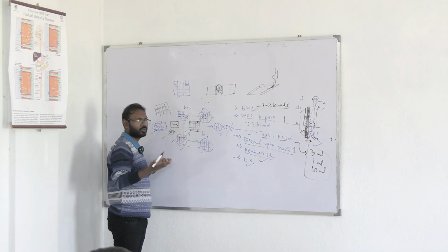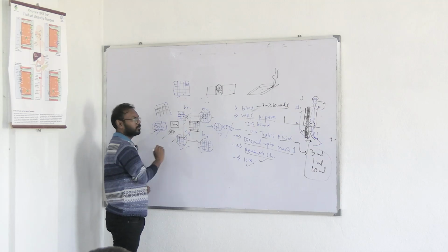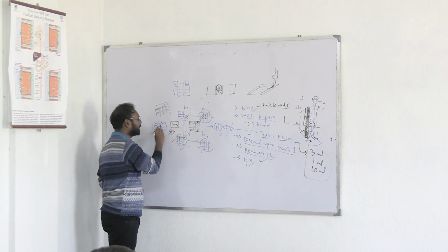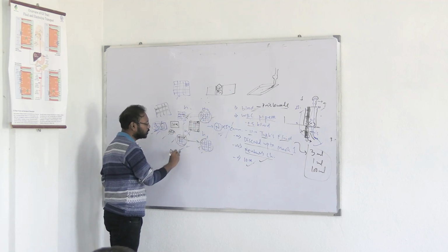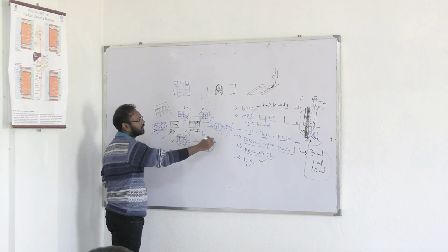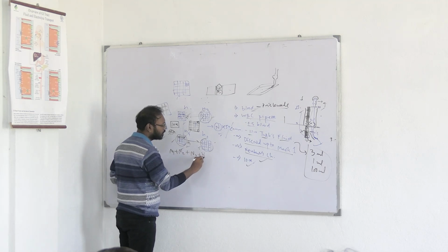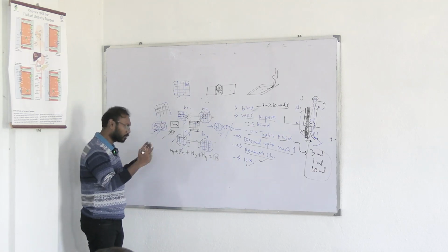The procedure, we don't care. At least I don't care. Okay? Because the calculation is important. Now on an average, you will see, what did I say, 50n. This n is equal to the total number of cells in this area. So say n1 is found here, n2 found here, n3, n4. The 4 numbers of cells, symbolic numbers. So n1 plus n2 plus n3 plus n4 is equal to total n. So the shortcut of the calculation is 50n.